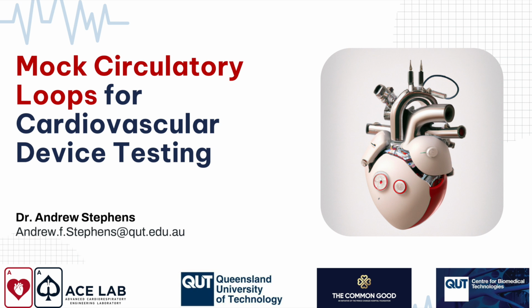Okay, the last slide on mock loops is hybrid mock loops. I just want to touch on this briefly. Hybrid mock loops combine mechanical and numerical elements to reduce hardware and space costs, and accurately simulate individual compartments. So at the moment, we've got all of the vessels lumped together in an aortic compliance chamber. But say we wanted to measure just the outflow from the top branches coming out of the aorta, we could do that numerically without having to create complex physical components.